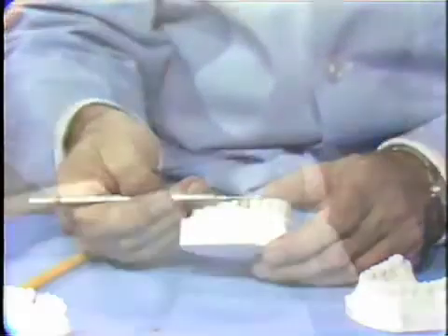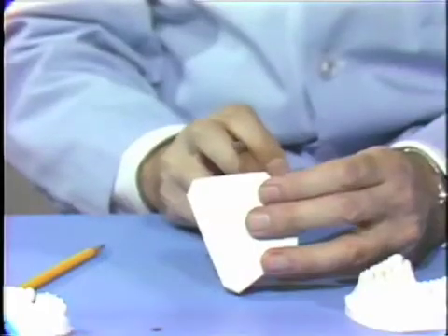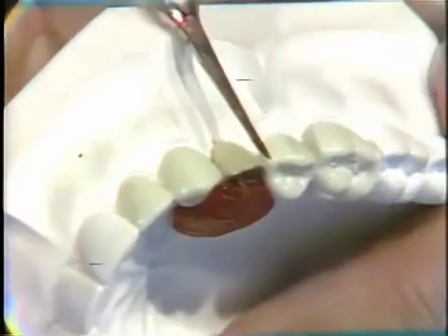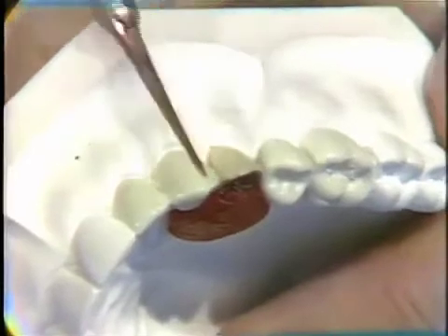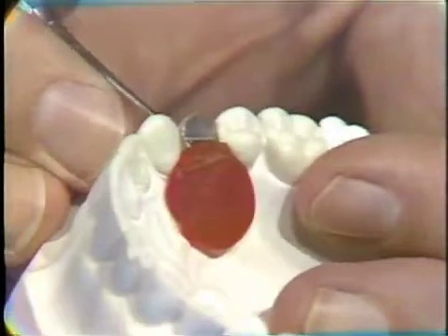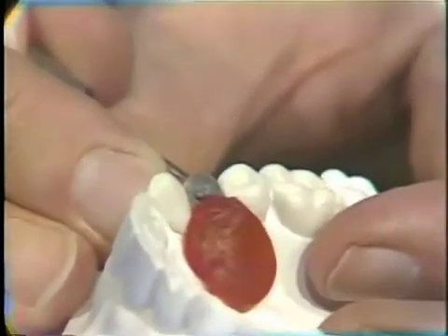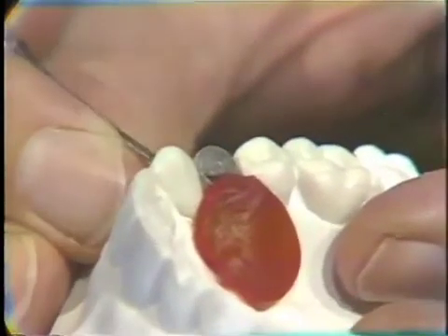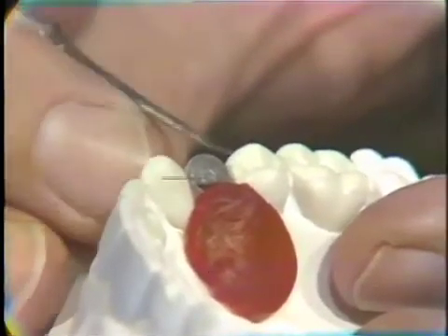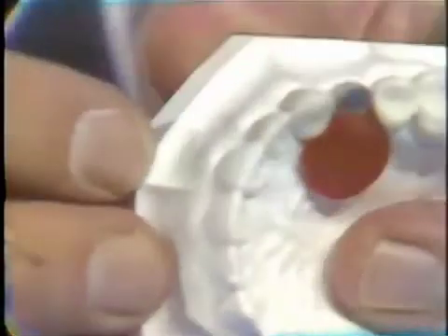So you've got to get the relationship on the buccal correct. You've got to get it correctly aligned in the pontic space so that the mesial and distal embrasures are in the relationship that you want them, that the long axis of the tooth is exactly where you want, and that it's positioned so that you've got an equal space on either side in the contact areas. You don't want it right up against one tooth and a wide open space on the other. You want to distribute that space nicely between the two sides of the pontic, and check it very carefully from all directions and angles to make sure that you've got it in exactly the position that you want.